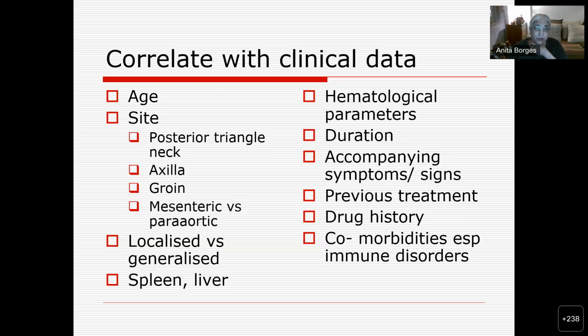So then you have to go back and figure out, this looks small, this is a diffuse kind of process. So why is it looking small and diffuse, and this is a 10-year-old kid? Then look carefully, you've probably got bad histology because the fixation was poor, and those small cells are probably lymphoblasts.